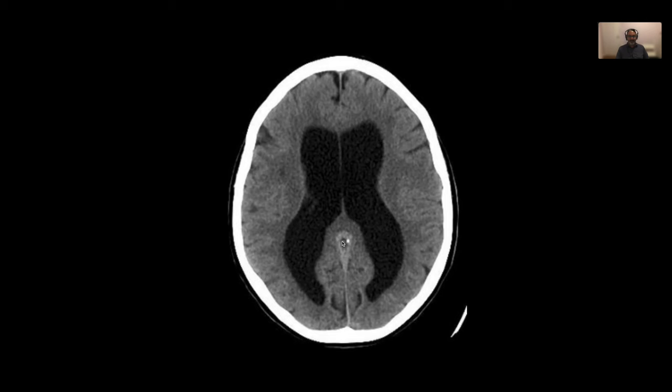All right. What is that? Big ventricles, absolutely. Yes. That's just too much CSF. Sorry, hydrocephalus.